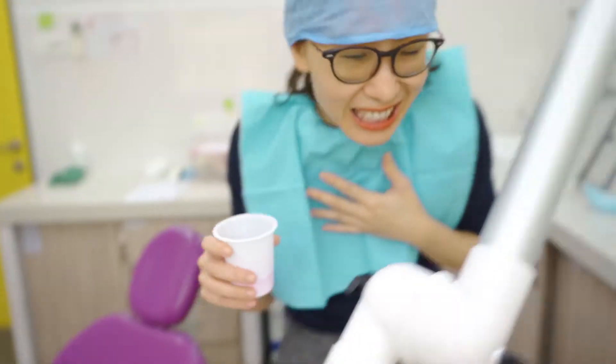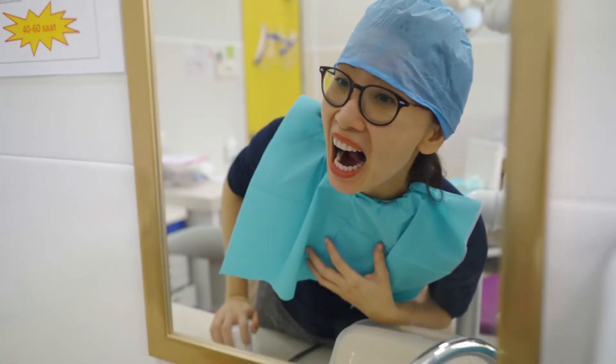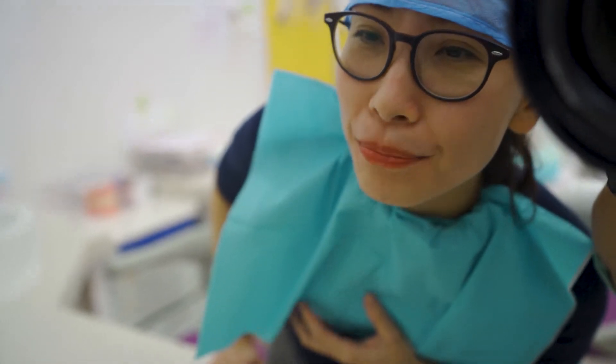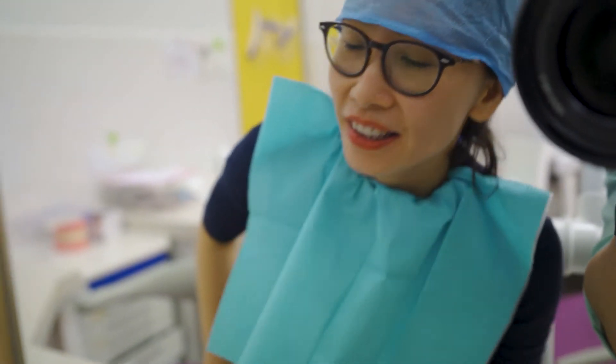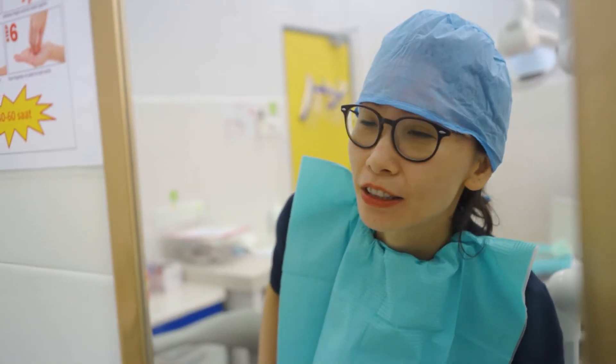Alright, now we check by looking at the mirror. Can you see where it's purplish? Pinkish purplish — mainly at the interdental region and on my tongue. The surface facing the tongue and facing the palate. Alright, the outside is cleaner than the back surface. This is what you see for not brushing after lunch.